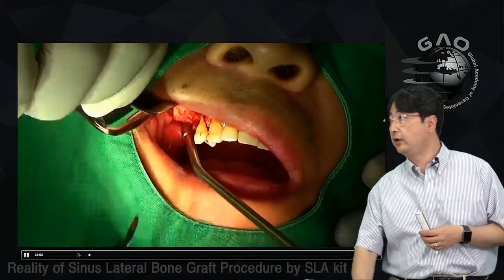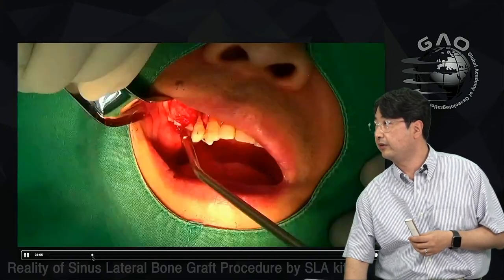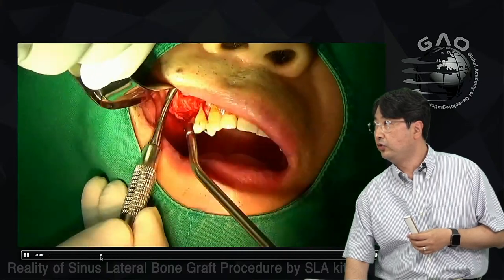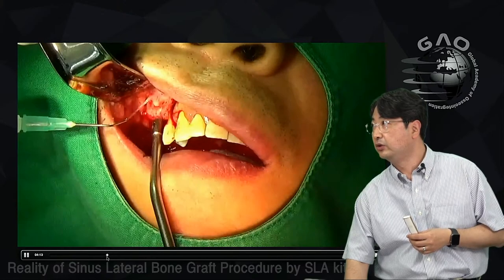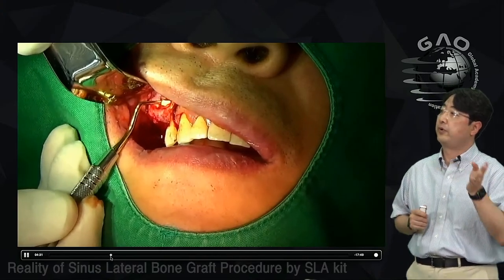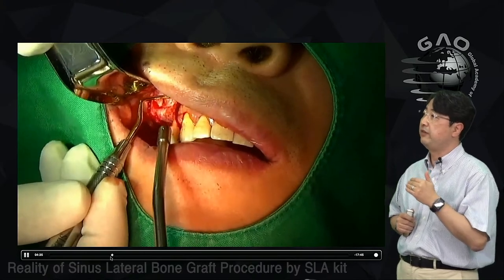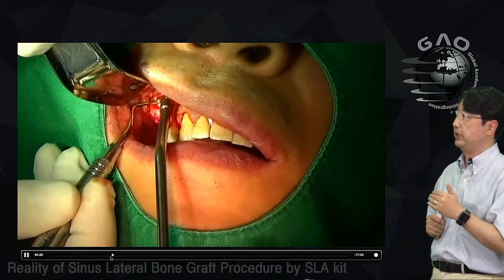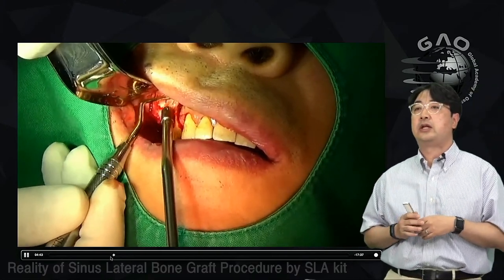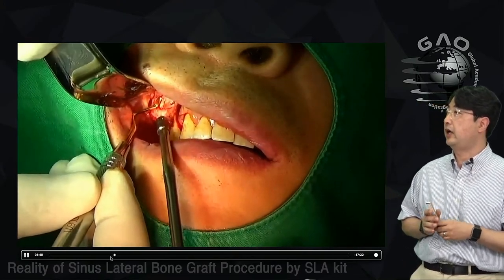So this is a very careful procedure, right? You don't want to have sinus membrane tearing again, and believe me, you have to have enough time to do this. Now I separate the periosteum and the muscle. Now you can see the previous window, the previous opening from the previous sinus graft, right? So I do the same. I use the three elevators, 1, 2, 3, right? So here I have 1.